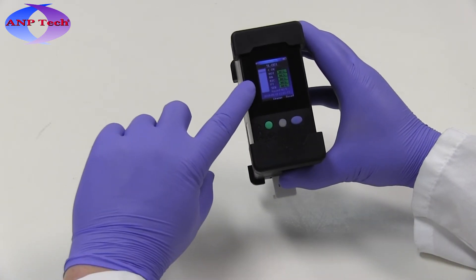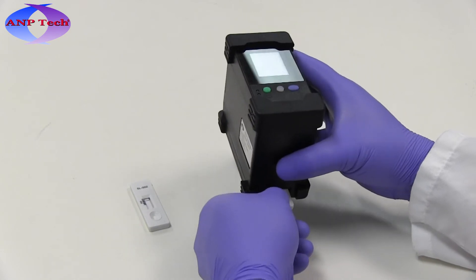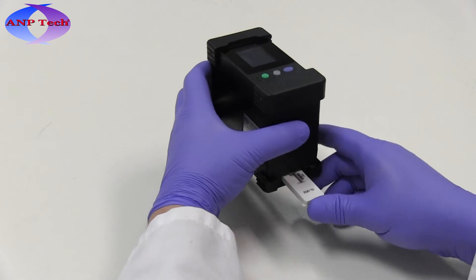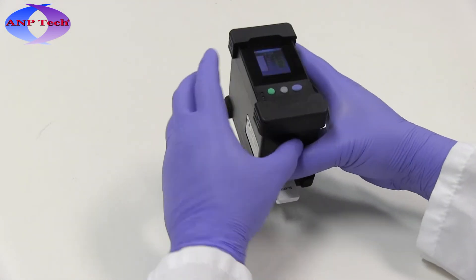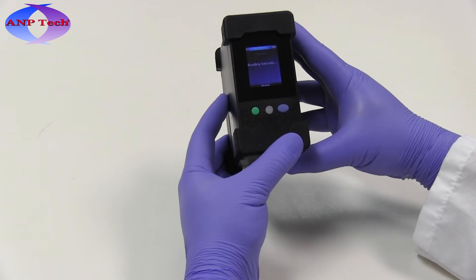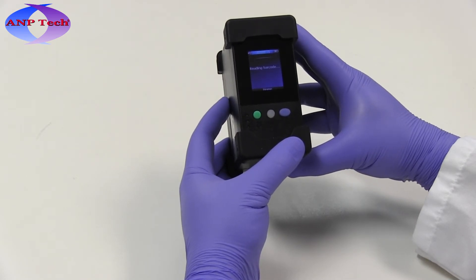To read another assay, simply remove the first and insert the next. Press the Read Assay button again to initiate the automatic analysis. There is no need to return to the home screen when running multiple assays during continued operation.